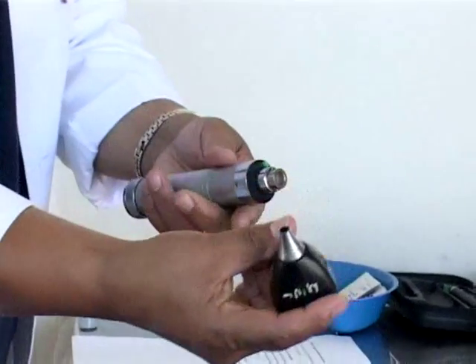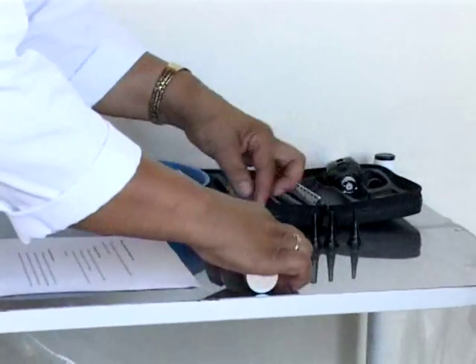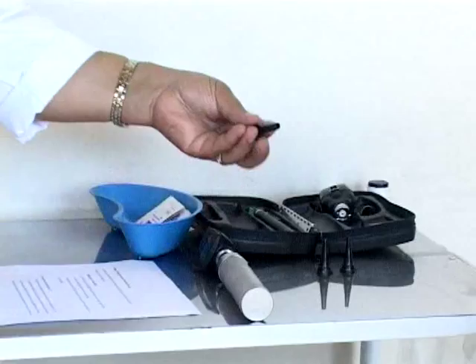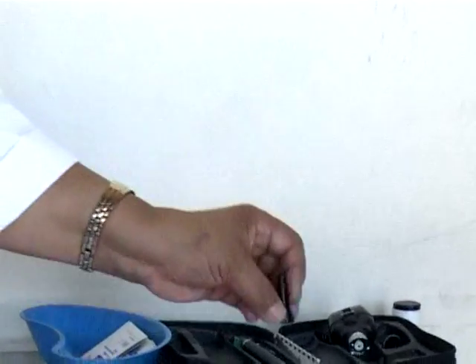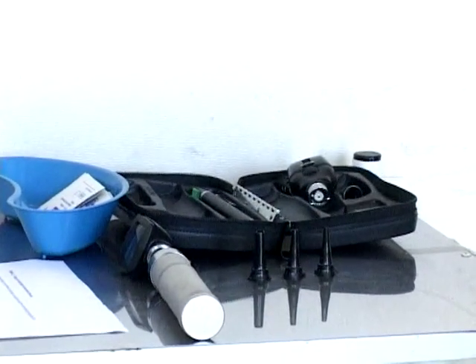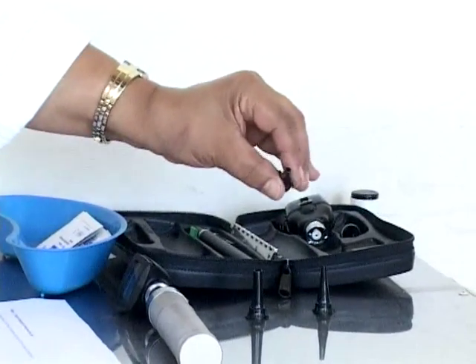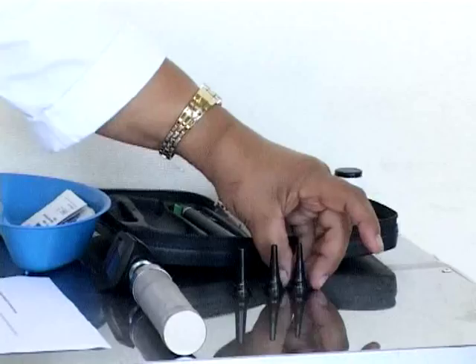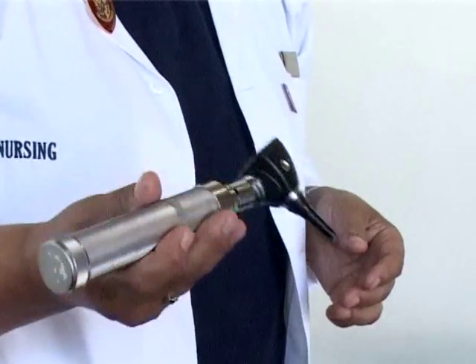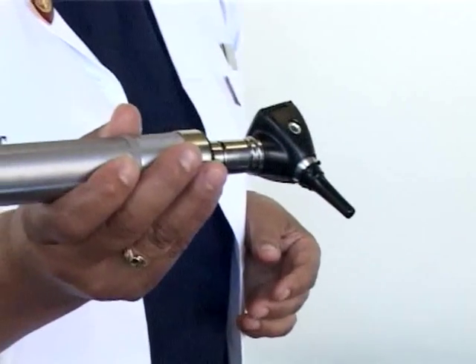The head of the speculum must be put on properly. With the otoscope you also have earpieces, and each earpiece has a different size. The largest size is usually used to look at the ear more clearly, but if you want to focus or zoom in you can use the smaller sizes. The otoscope must be held like a pen to ensure you don't hurt the patient.